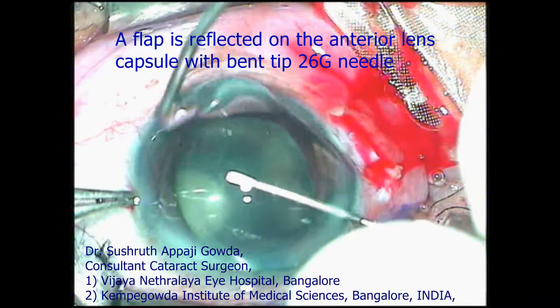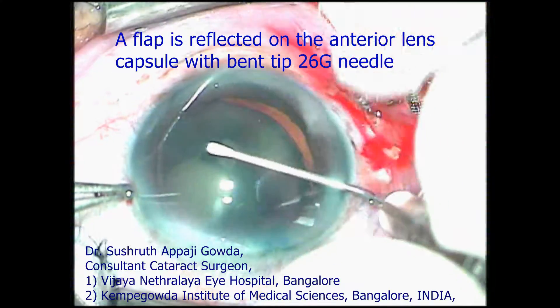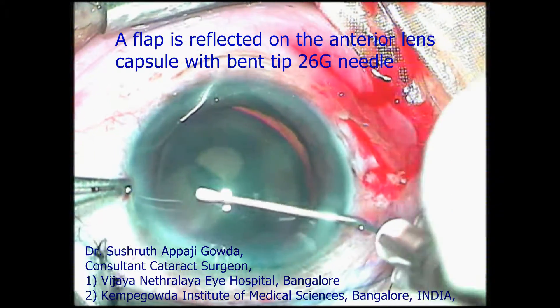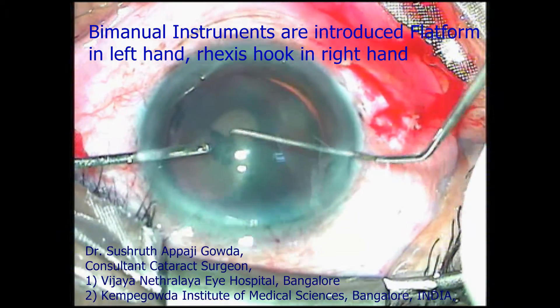A valve incision is made at 12 o'clock. The anterior lens capsule was stained and a flap was reflected with a bent 26-gauge needle. Then we introduced the bimanual instruments for rhexis making.